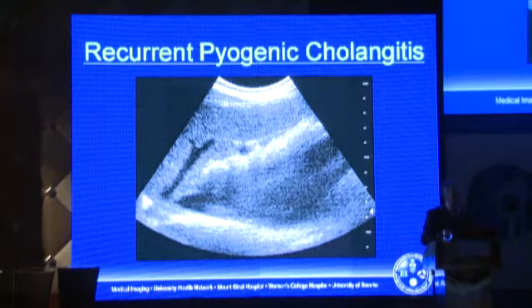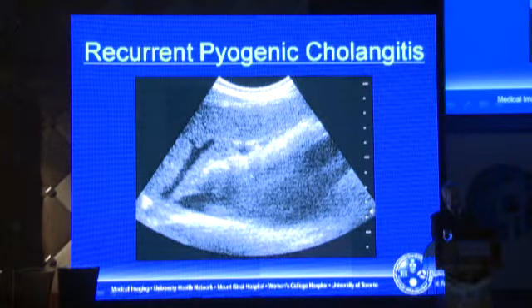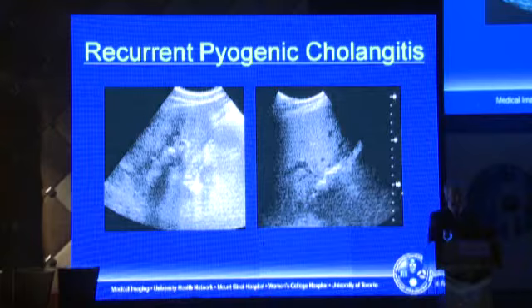And here's an example. This is a scan of the right lobe of the liver. We're looking down along segment 6 here. Note it almost looks like reverberation artifact, but there's something here. And if you're unsure, you can always go to CT.